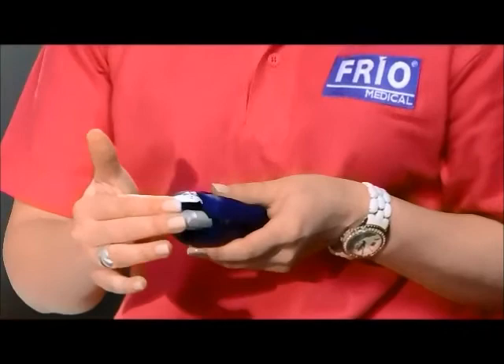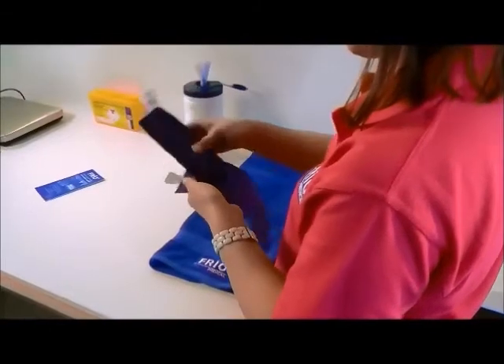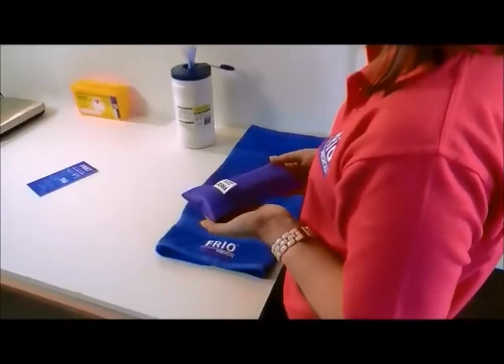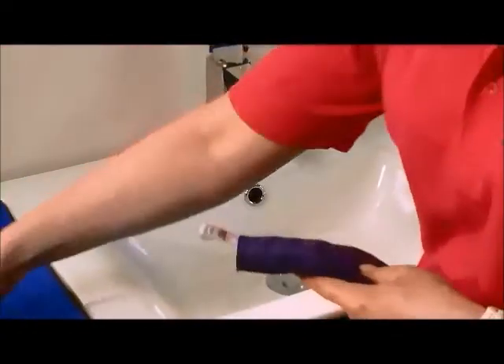You can now insert your medication and place your wallet inside the cover. The Frio Wallet has been independently tested and certified regarding its effectiveness. It can be reactivated simply by placing it in water again when required and can be used repeatedly.